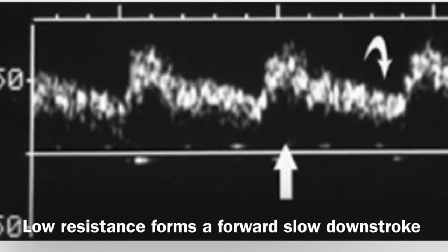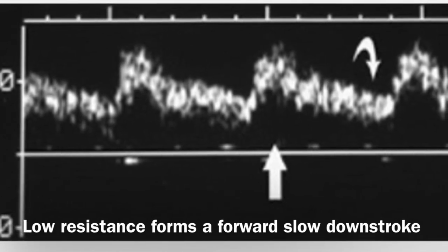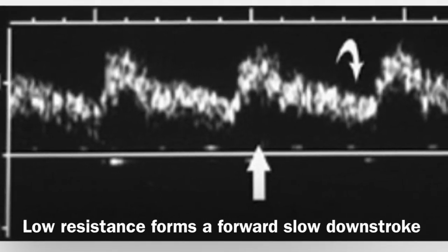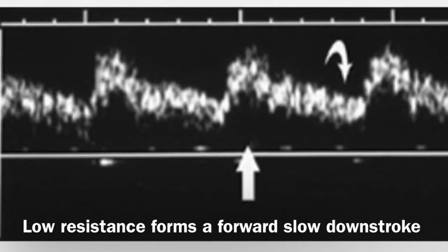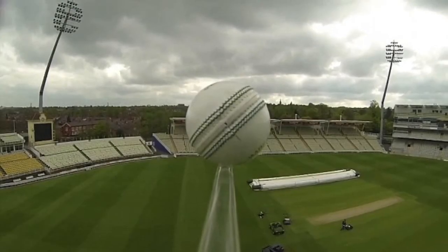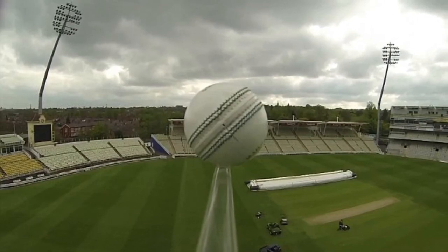Or the downstroke may be less abrupt, not falling rapidly to form a forward flowing wave. This happens when the distal arterioles show less resistance and a capacity to perfuse the downstream organ, like the brain or the kidney. Like the example we said above, the ball we described before hitting the wall now is flowing out of the stadium.